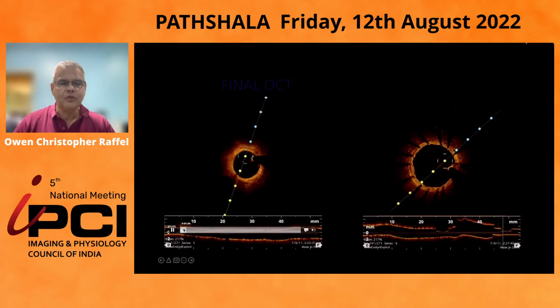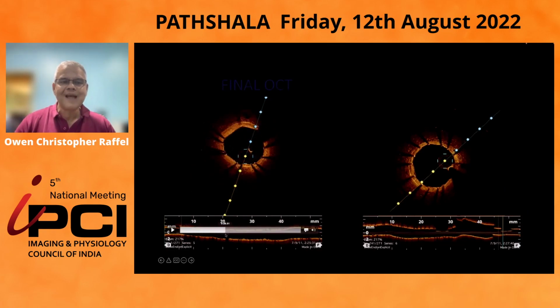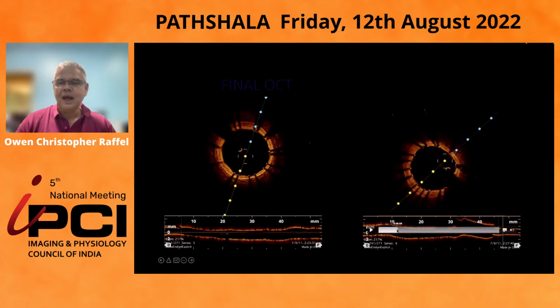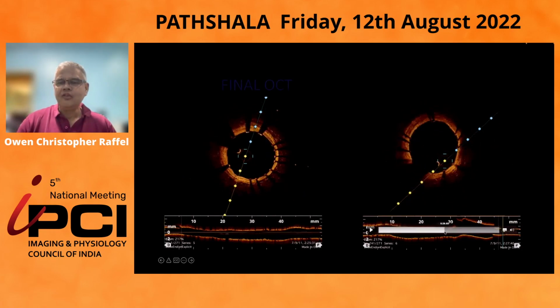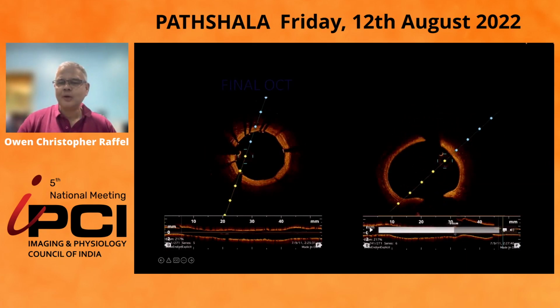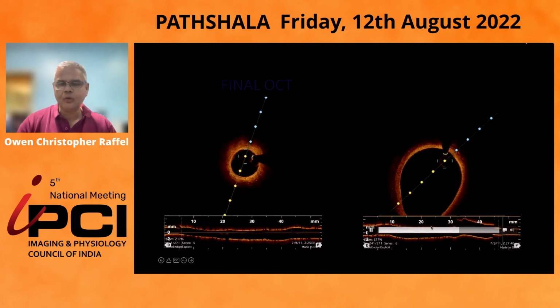This is the final OCT, and as you can see, no distal stent issues. You can see the hematoma tacked up by the stent, beautiful imaging with OCT. This is the advantage really with OCT here. And then looking at the entry sites being blocked off, and more importantly, our left main, no extension of the hematoma into the left main, which is obviously very important.